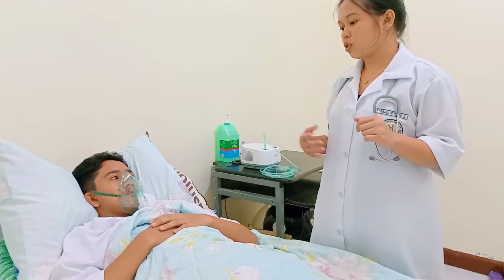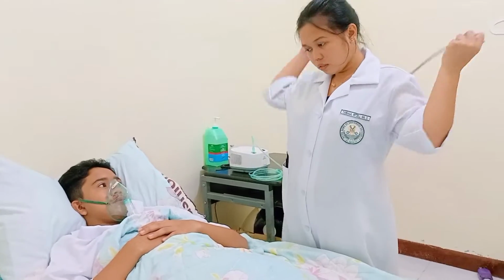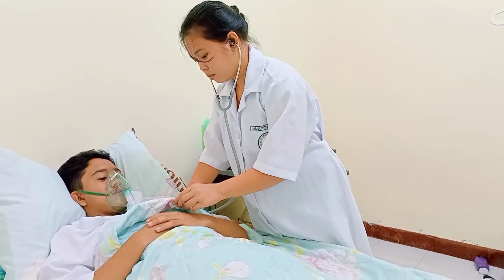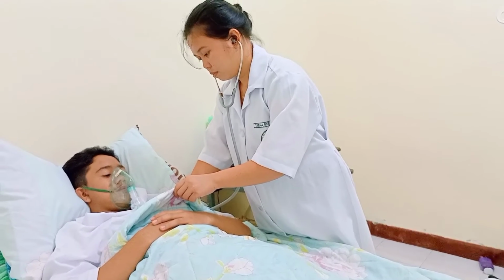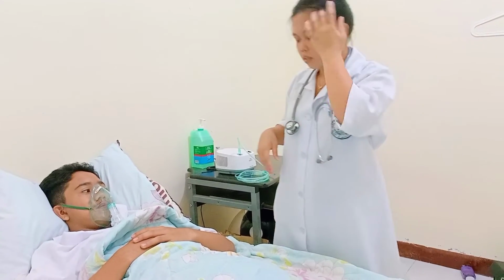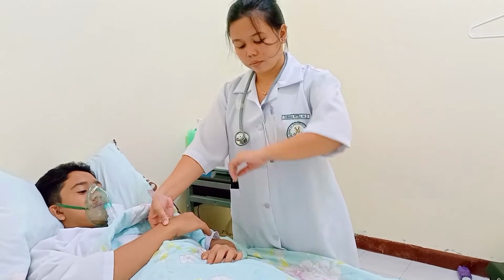So sir, I will auscultate your breath sounds. And also observe the skin color, level of anxiety, and oxygen saturation level.